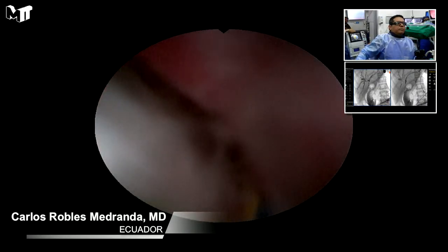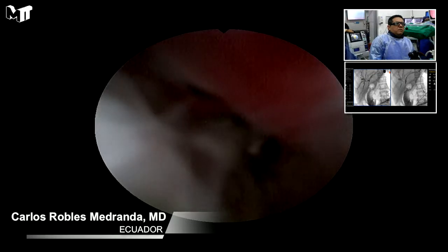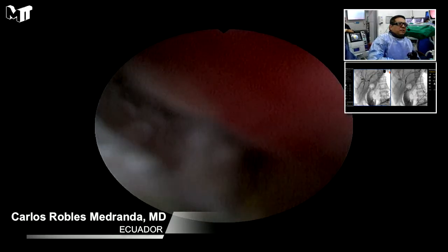So this is anastomosis. Yes, I'm sure now.